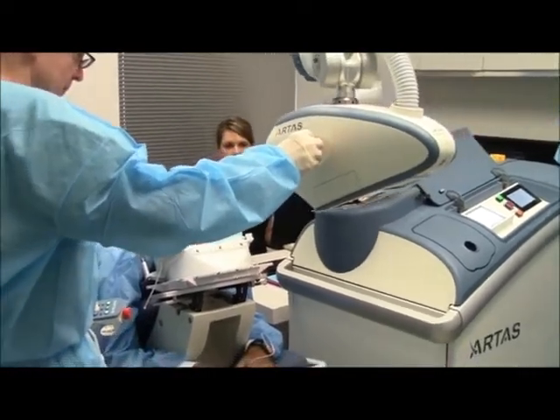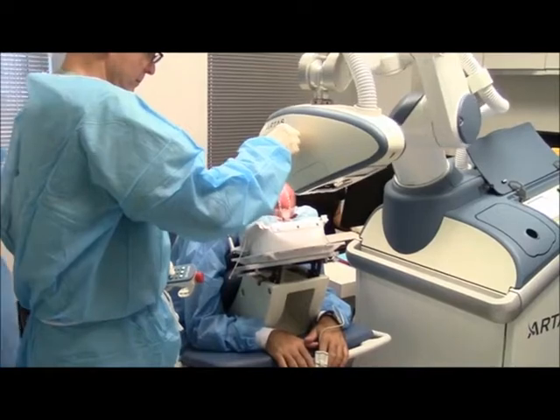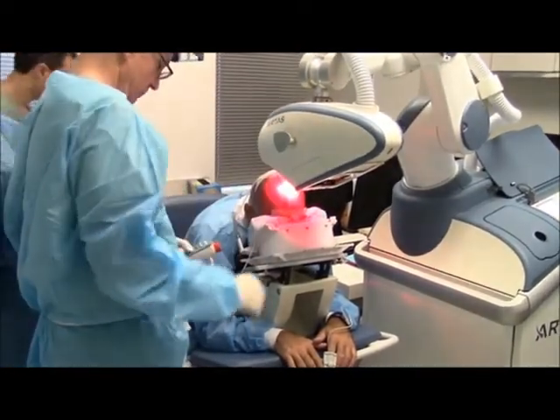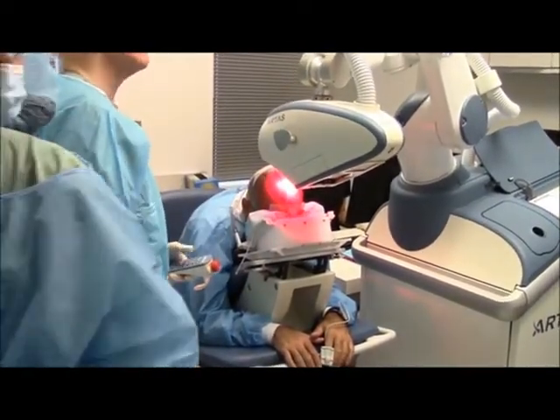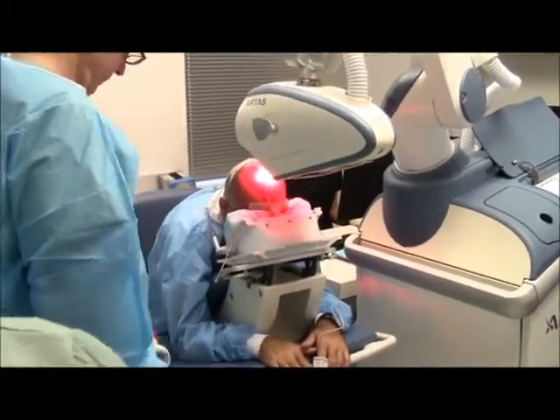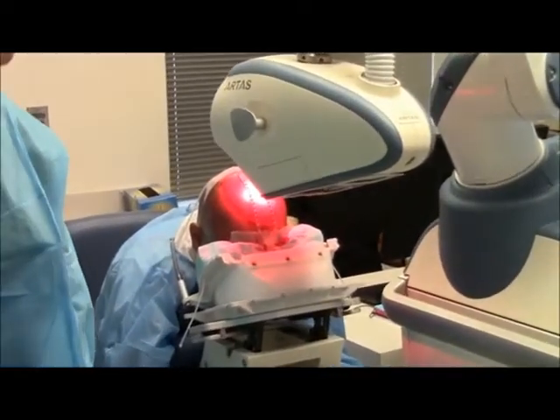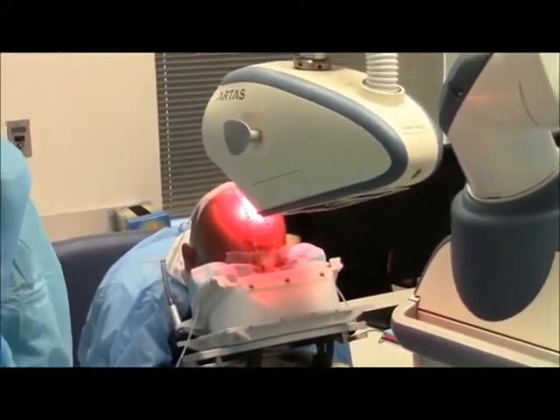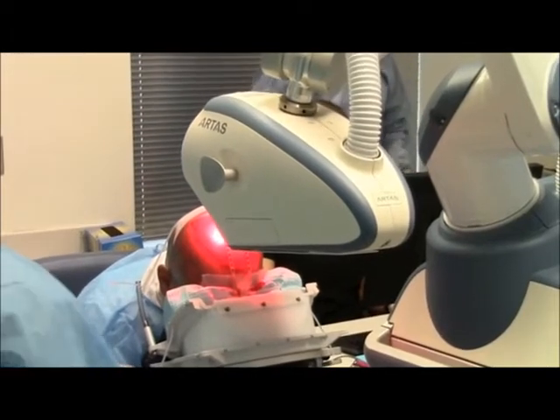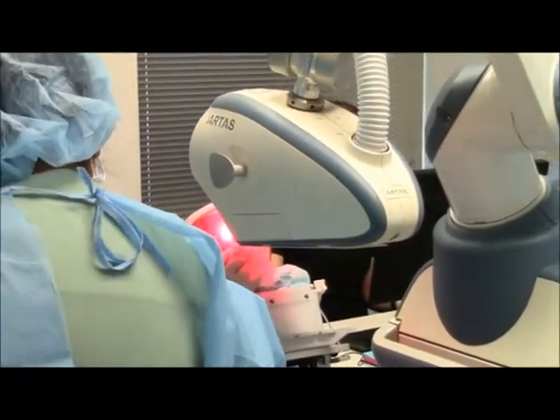I'm going to move the robot into place. There are two guiding lights, and when these signals converge, we know we're at the right distance. Then the robot starts to take over. This robot has already been pre-programmed for the distribution, the density, the angle — it's all ready in place. The robot now automatically follows a pattern that I had programmed into the computer a little while before.